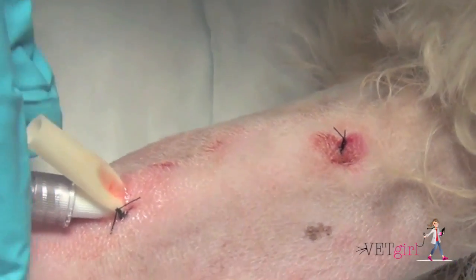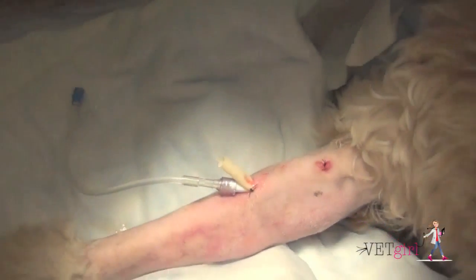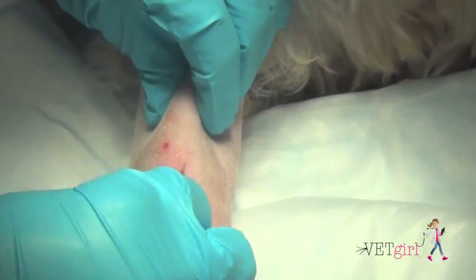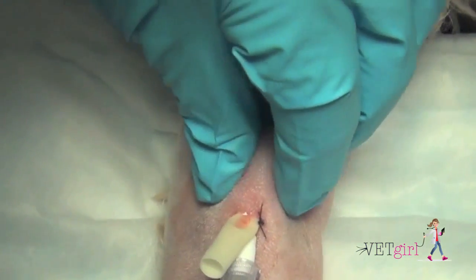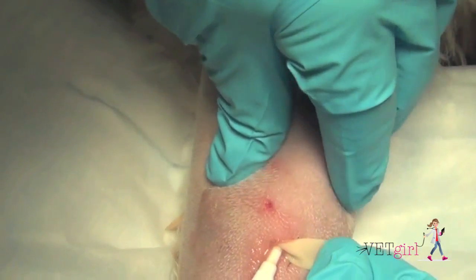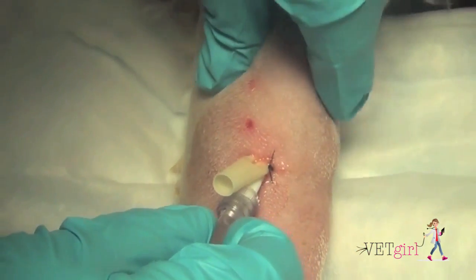That distal tacking suture can go through approximately a third to half of the drain, but you want to make sure that it doesn't occlude the opening at all. We're going to trim the Penrose drain, more importantly so the dog doesn't chew on it. The most important thing of treating an abscess is making sure we're providing an opening that can drain and flushing.